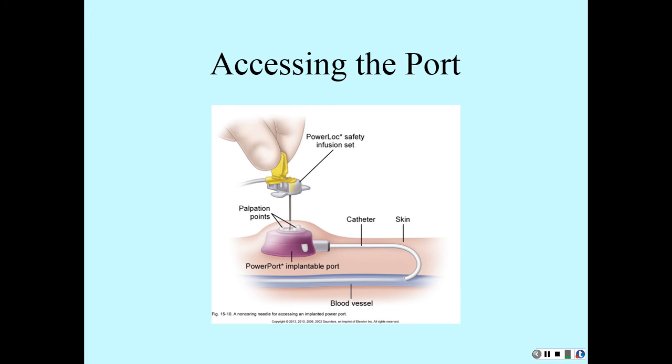There are different kinds of those implanted ports. Some of them are square, some of them are rectangle, triangular, round. You just have to palpate to see what you got there. And I actually have given thrombolytics to declot a port like this. Worked well too.